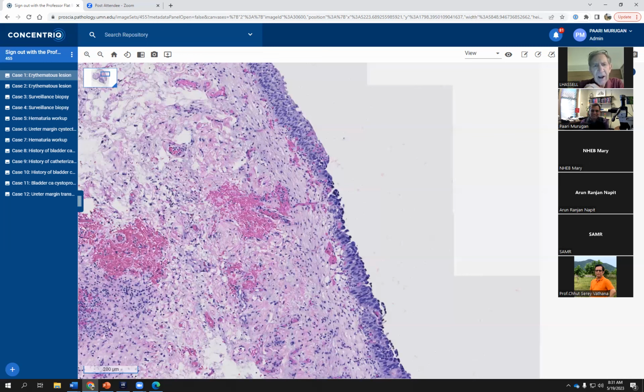I often have been inclined to use P16 as a marker for that circumstance where you have a null mutation and may find the staining very weak. Have you ever tried that or used that in the bladder? Not in that context of P53 mutation, but you bring up a really good point, and I'm glad you caught on to that. The second example that I showed you in that PowerPoint was actually a null pattern of P53. It's uncommon.